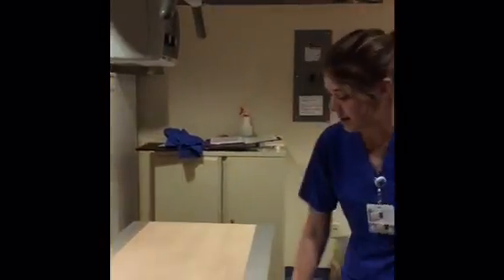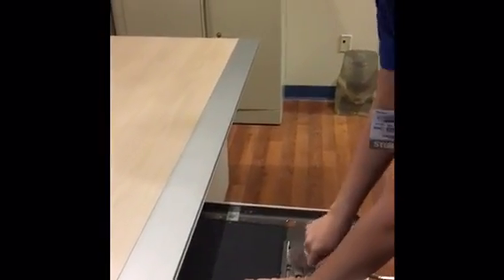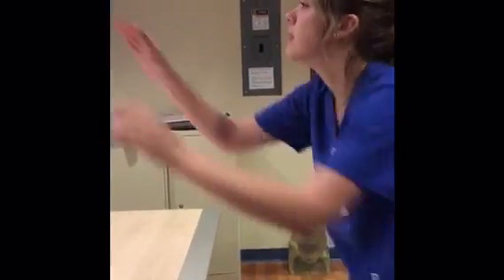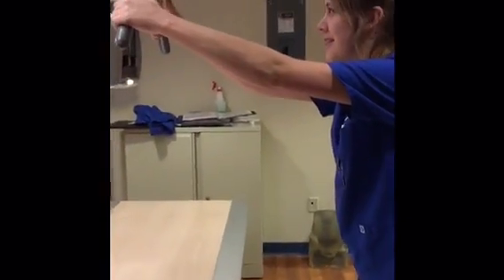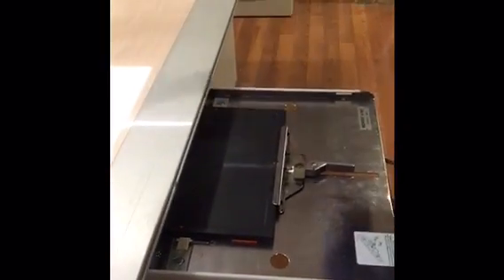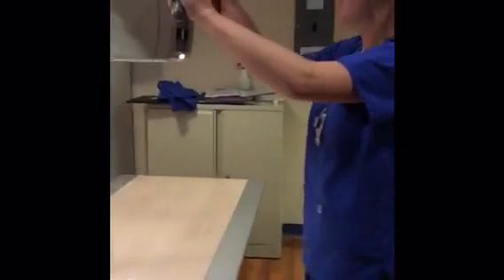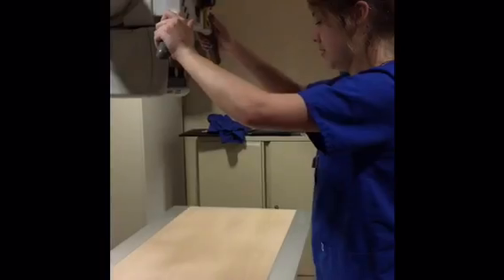These projections will be done on tabletop. I will use a 10 by 12 lengthwise cassette in the table bucky. I will make sure that I have an SID of 40 inches, making sure that my tube is detented and aligned with the image receptor. Now that it is aligned with the image receptor, I will again detent my tube.